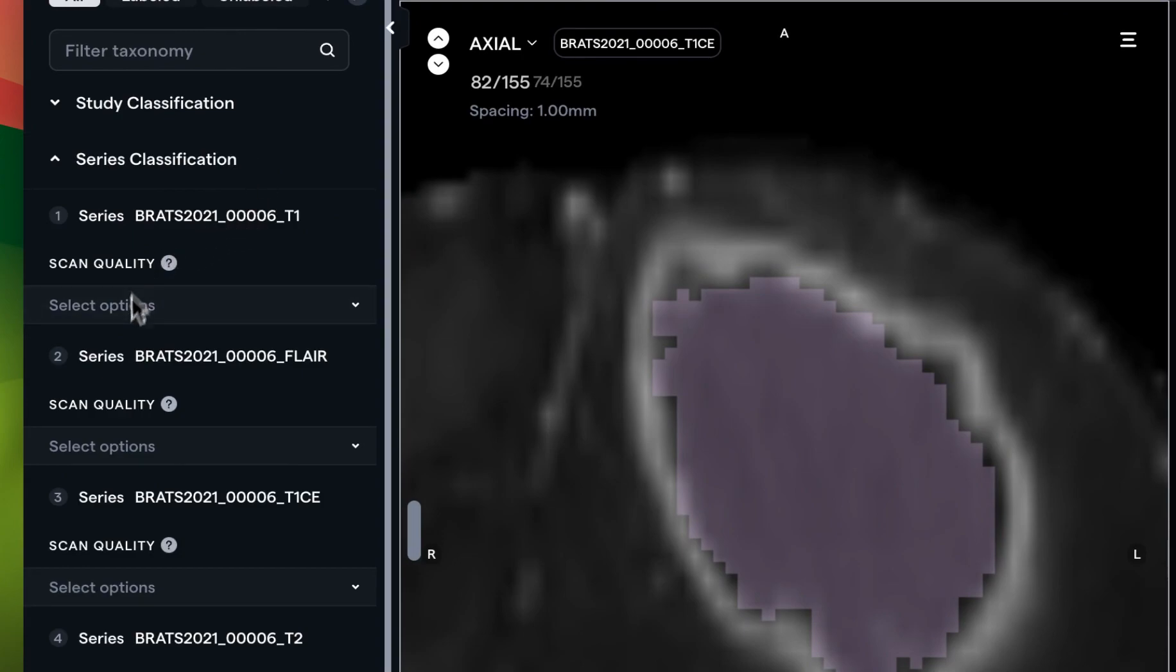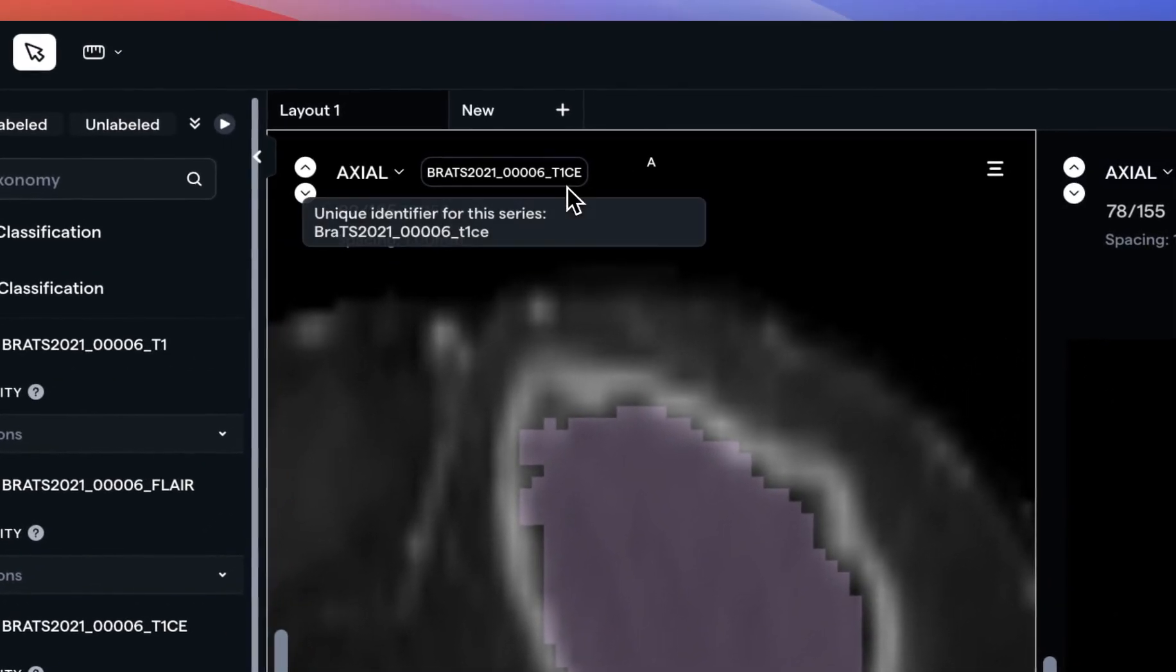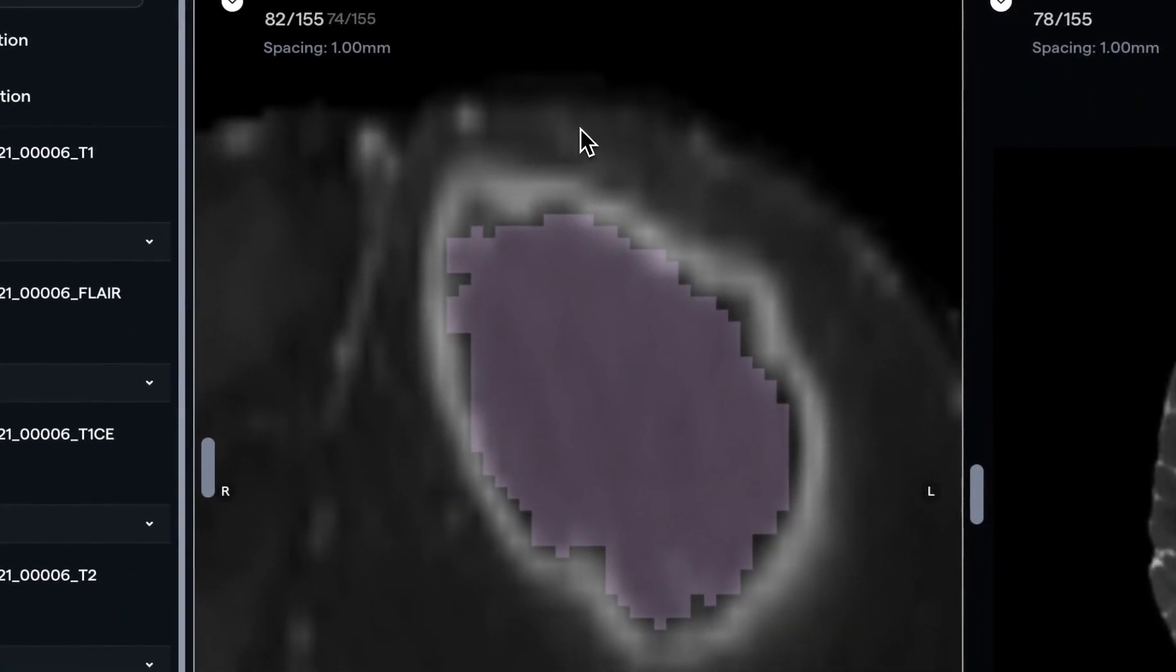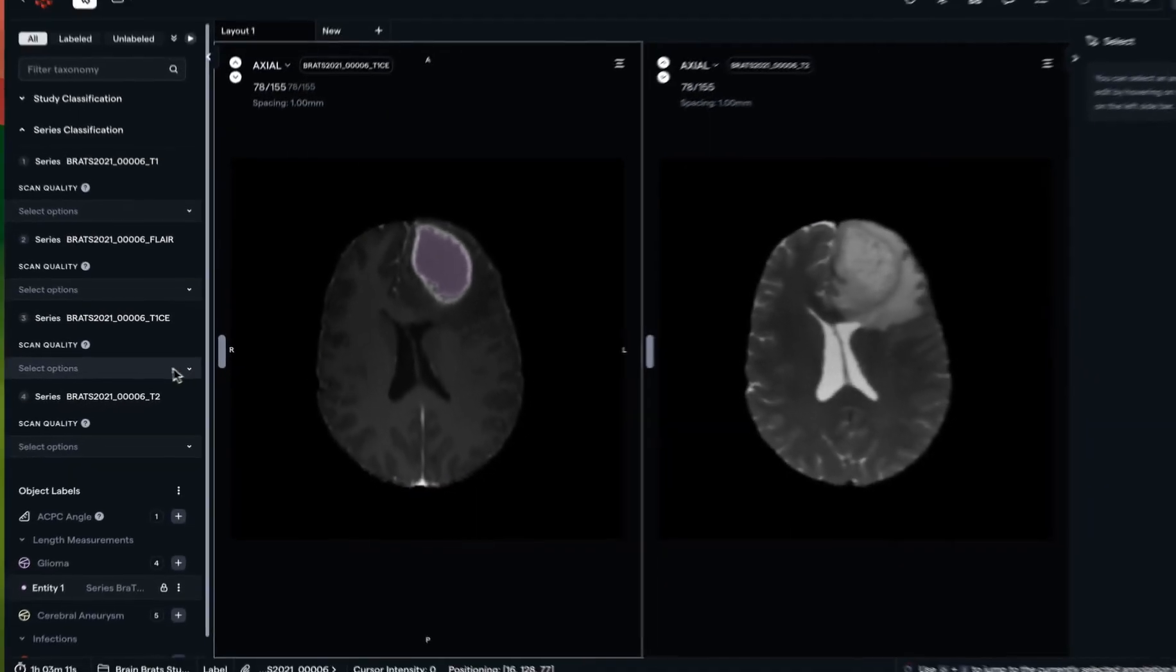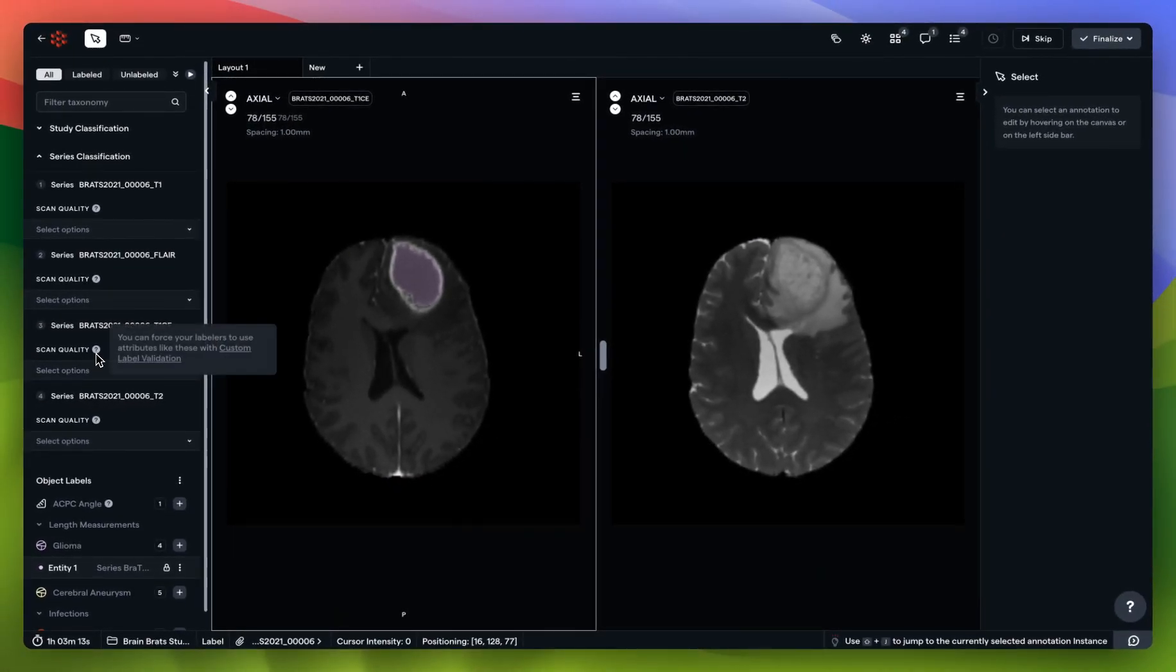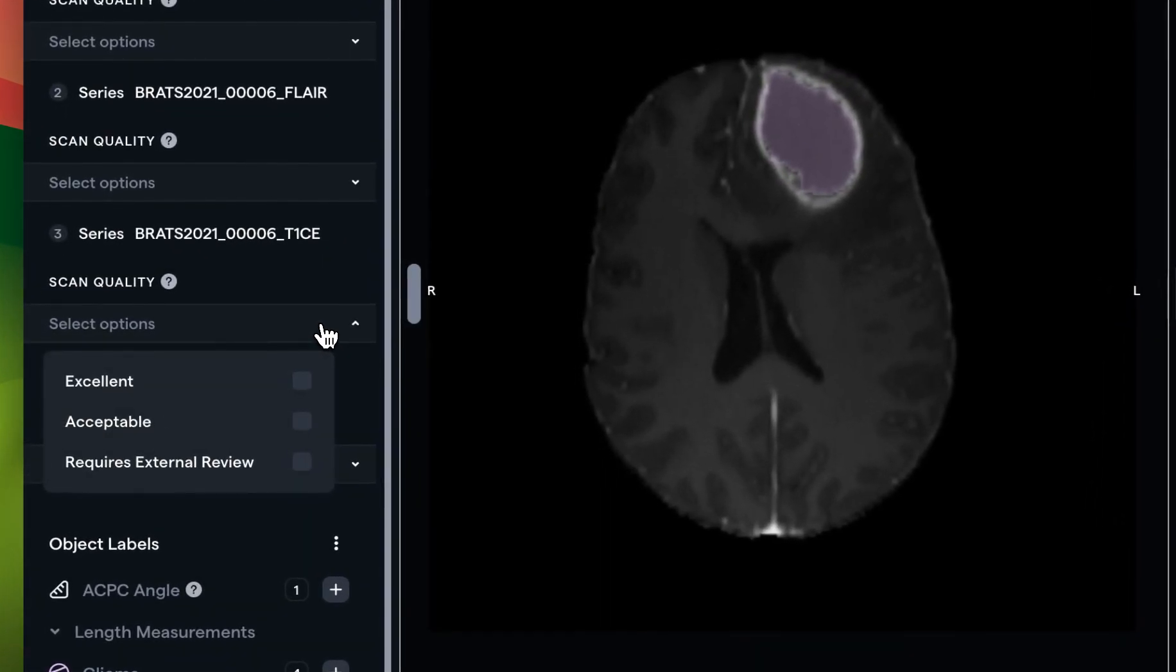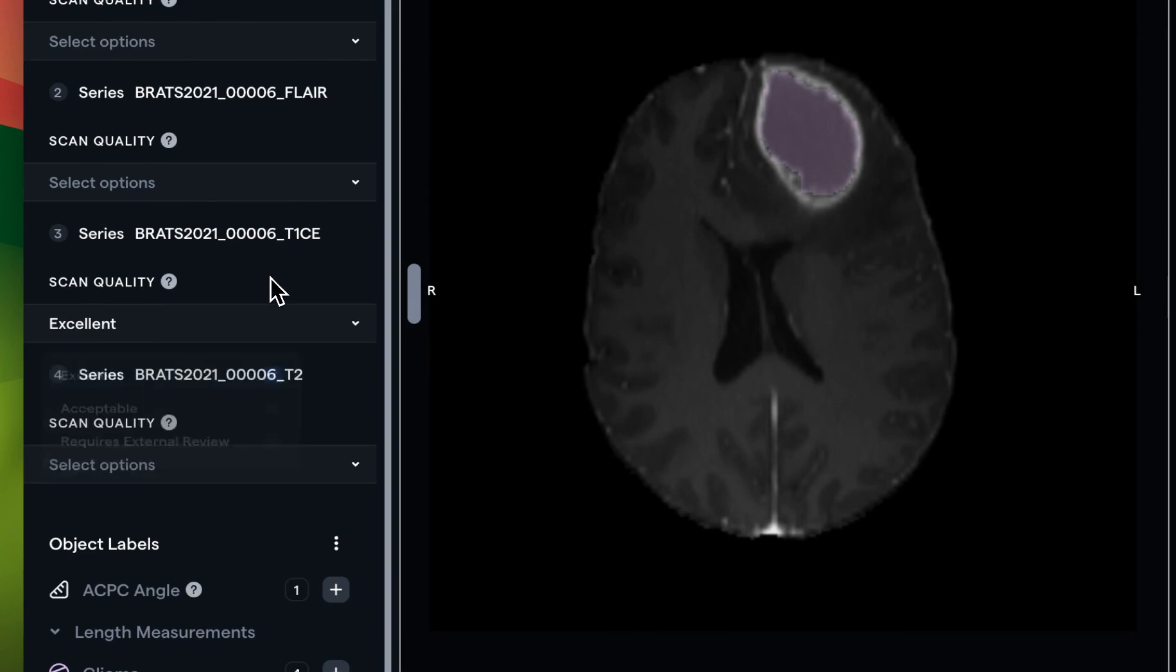Our admin seems to have asked us to make a determination of scan quality for each of the series available to us. We're working on the T1 contrast enhanced scan and I'll click space to reset my views. I've been asked to make a determination of scan quality, so what I'm going to do here is just open this menu and let's say this is an excellent scan.